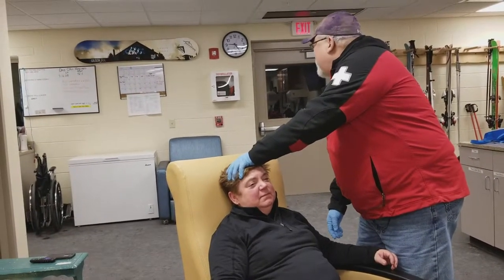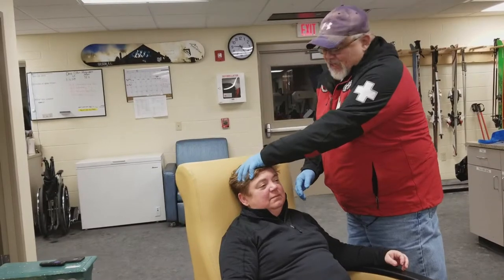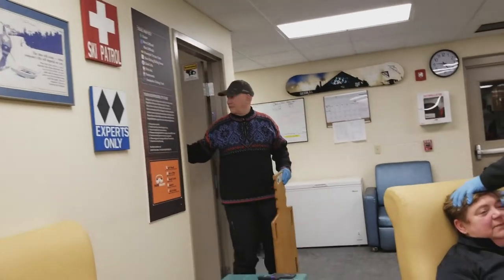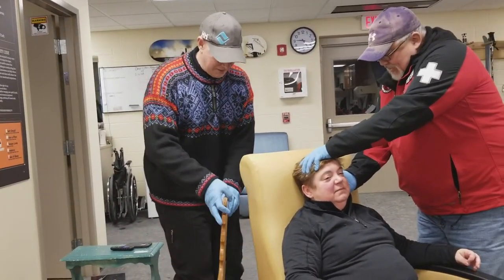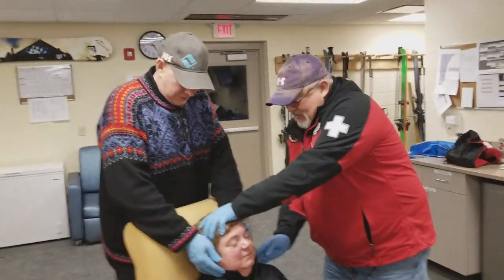Hey, John? Yo. Got it. Can you bring a short board and yourself out here for a second? Yeah, you bet. I think what we need to do is call the squad and have them check you out — I'm a little worried about the numbness and tingling. Could you take C-spine here? Yes.